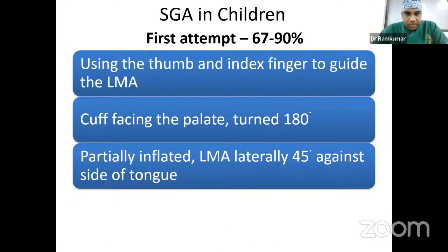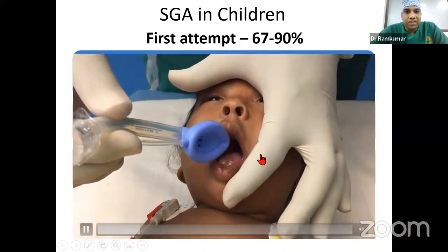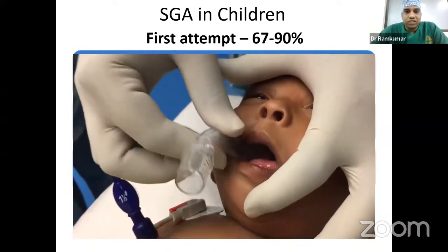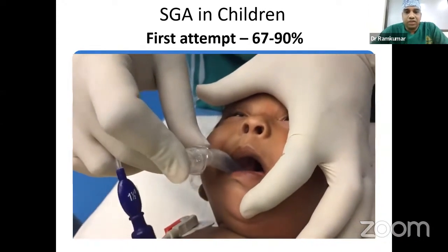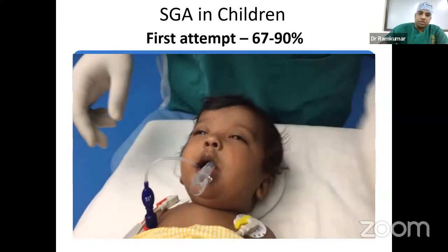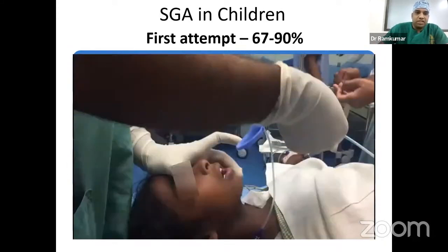Another one was published in Pediatric Anesthesia by Ramachandra. This is a partially inflated LMA inserted laterally at an angle of 45 degrees against the tongue. This is the technique: partially inflated cuff, inserted laterally at an angle of 45 degrees. Once it enters the oropharynx, it's brought into the midline position. Another technique is you can use a stylet device.